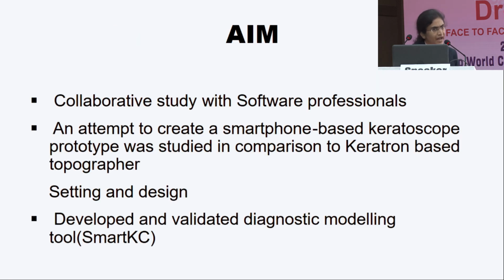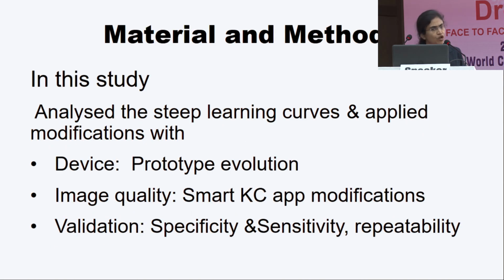So with this in our mind, our institute planned a collaborative study with software professionals, and we made an attempt to create a smartphone-based keratoscope prototype, and we developed and did a validation of a diagnostic model called Smart KC. So in this study, what we analyzed was the steep learning curve with respect to the device, the prototype per se, the image quality with respect to it, how we could convert and change things in the Smart KC app, and lastly validating this against a gold standard like the Keratron machine.